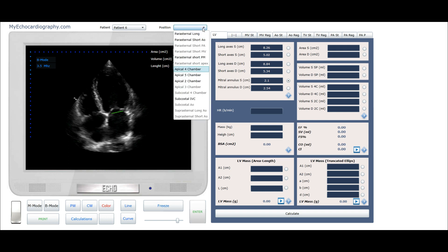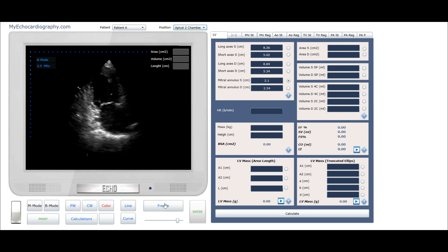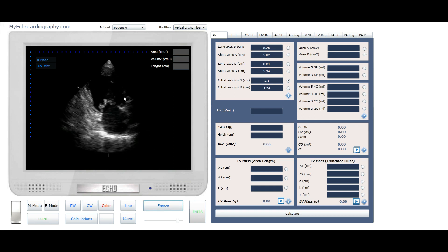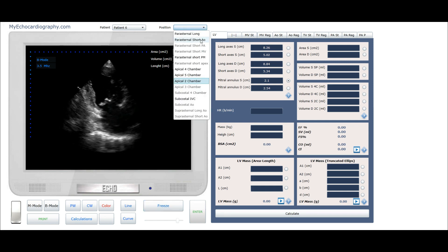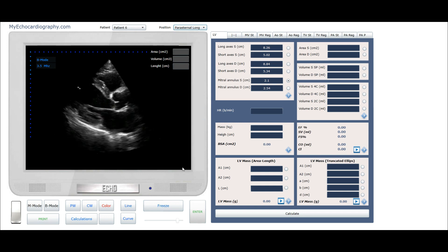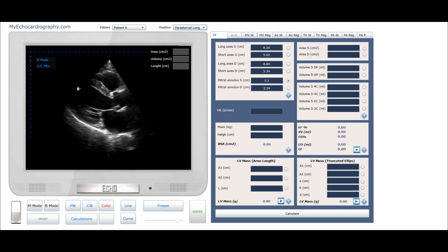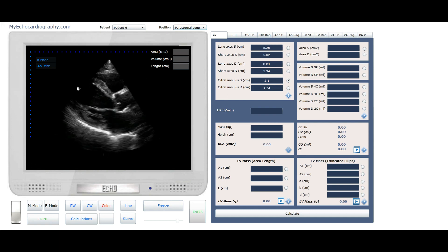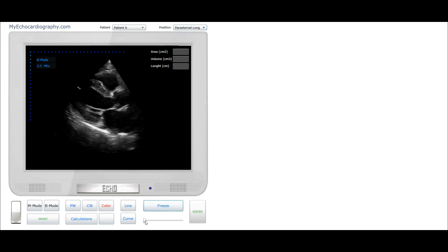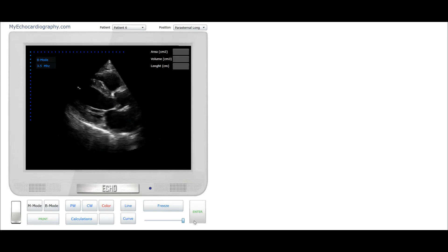The same measurements can be performed from the Apical 2 Chamber View and from the Parasternal Long Axis View. However, from the Parasternal Long Axis View we cannot see the apex, so measurement of the long axis of the left ventricle is not possible. From this view we can measure systolic and diastolic thickness of the interventricular septum as well.